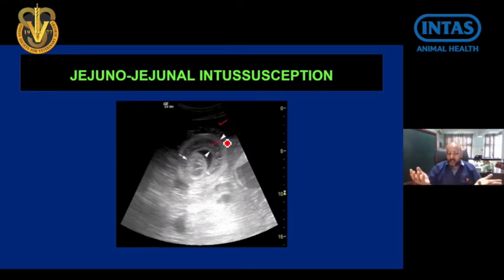So in this animal, you find fluid, you find wall thickening, you find amotility, and the cranial abdomen is showing a swirling movement. That gives you an idea that this horse needs surgery. Besides the other tests which you normally do to decide whether to go for conservative treatment or surgical treatment, by sonography you will get an idea of what is happening inside the abdomen.